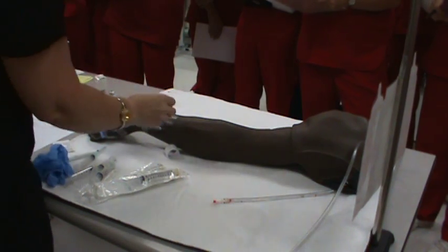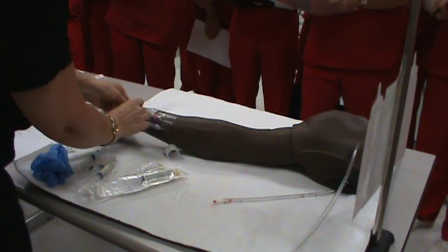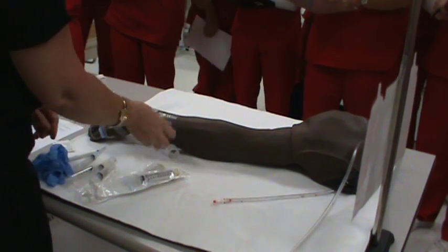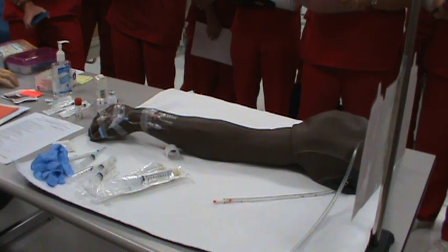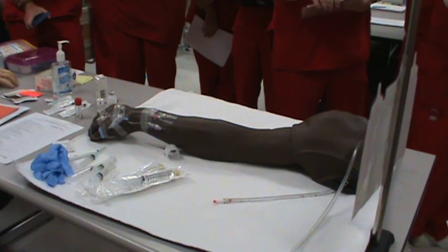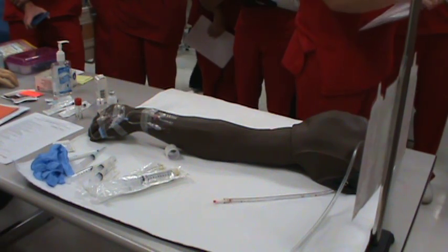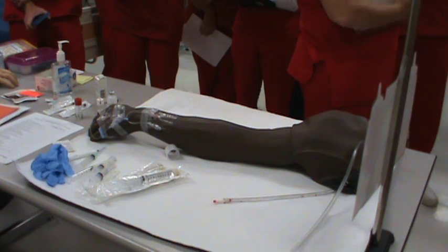You would bend it where the port is. Let me see if I can find the tubing, the tubing with the port. It's heavy.